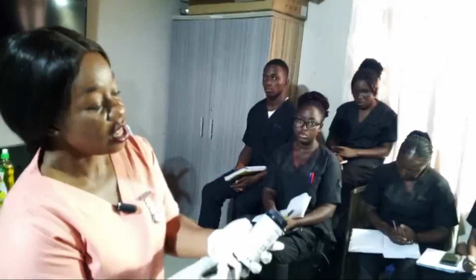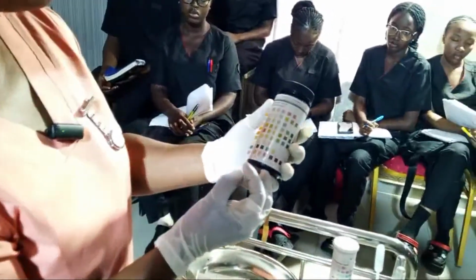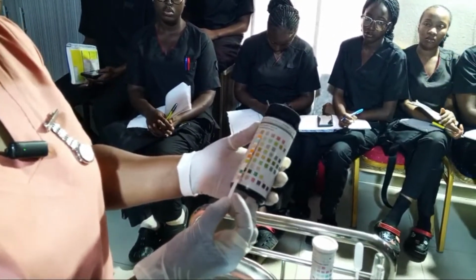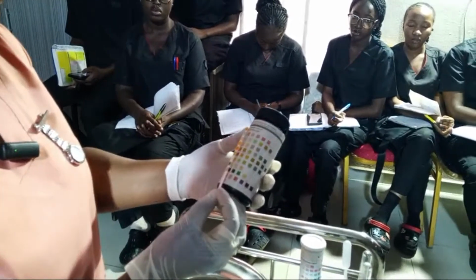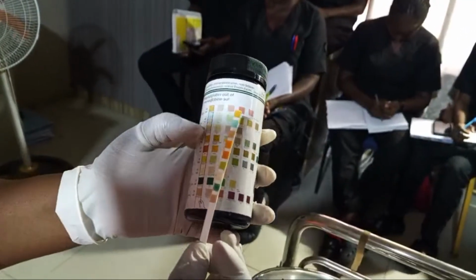So now let's go to glucose. For glucose, glucose is negative, as you can see. It doesn't change any color.